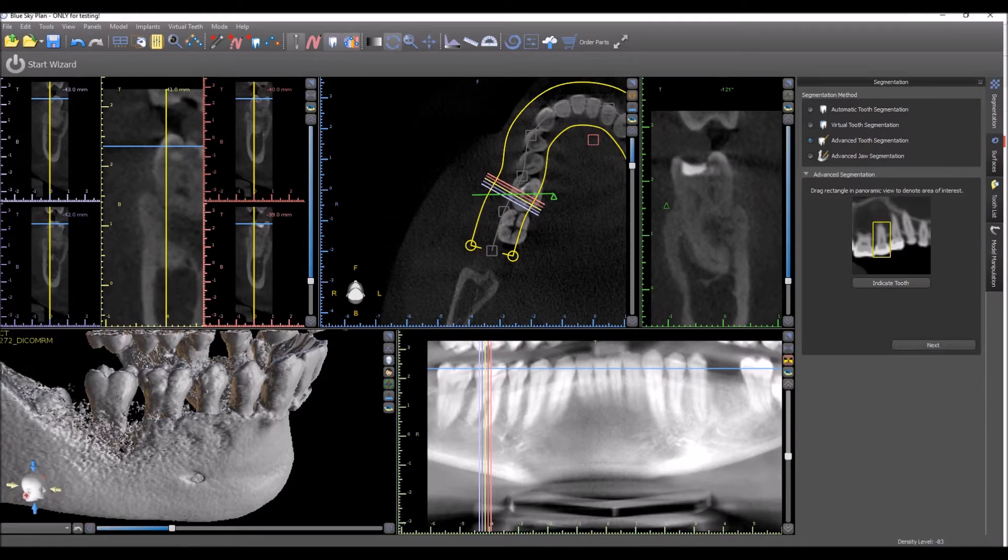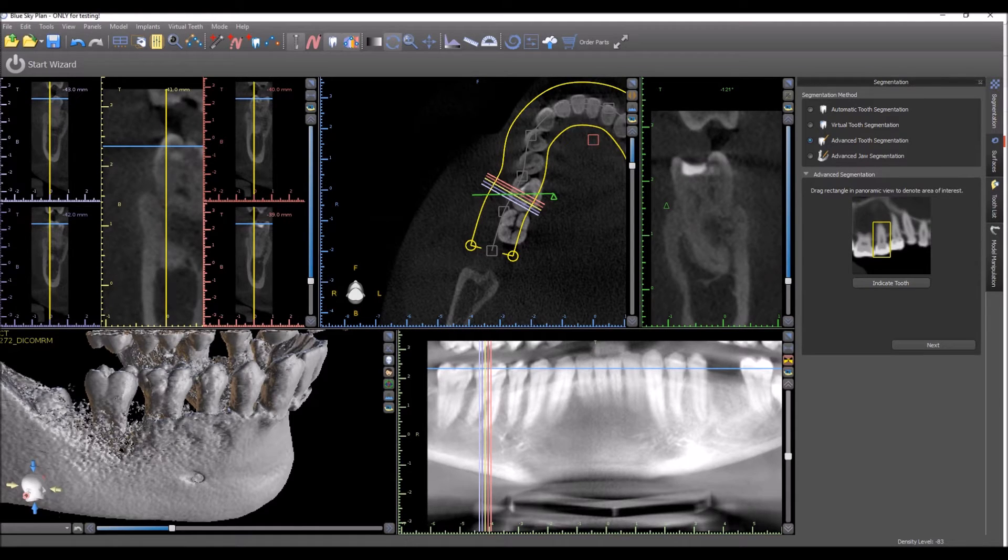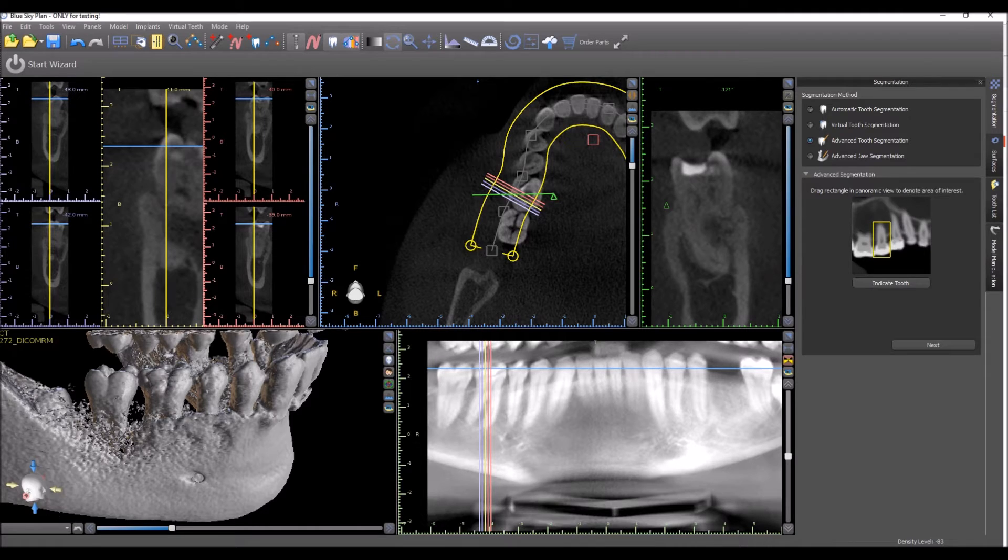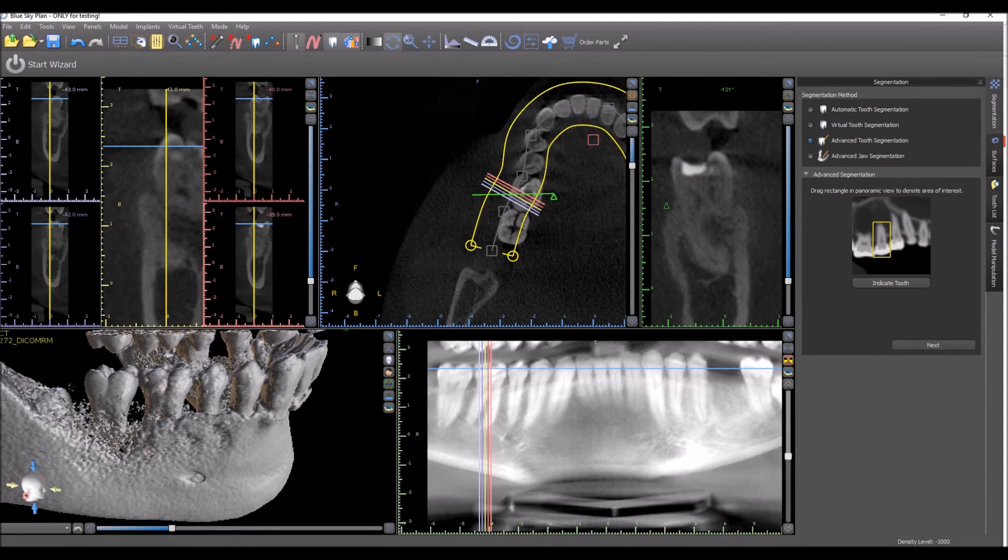We're going to take a look at the advanced tooth segmentation functionality. This is a way of extracting teeth from the CT scan and turning them into their own surfaces. The segmentation panel can be opened by going to the panel drop-down and choosing segmentation.